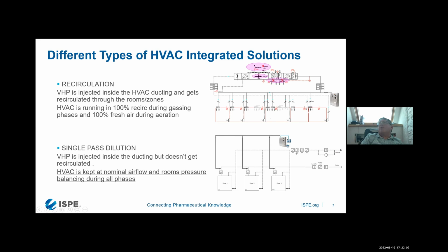the gassing will be quite rapid. So I would say in less than half an hour, we get the 6 log. So the gassing time is very short. It will be aerated by the VHP, because we don't want to put the contaminant back to the filter if we want to remove it, for example. Then altogether we'll make something like 3-4 hours max decontamination time. I hope it answered the person's question.